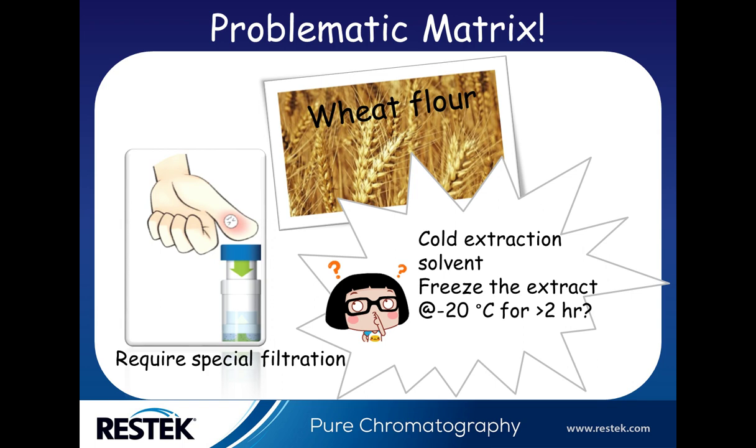It's really hard to push the plunger down to the bottom of the vial. Even when I could do the filtration, it also clogged my columns many times. In that case, I killed a couple of my columns. I hope my manager won't hear this because I didn't tell him. So I feel like it probably needs some special filtration, or some junk is stuck there. I don't know. So I stopped my work at that point.